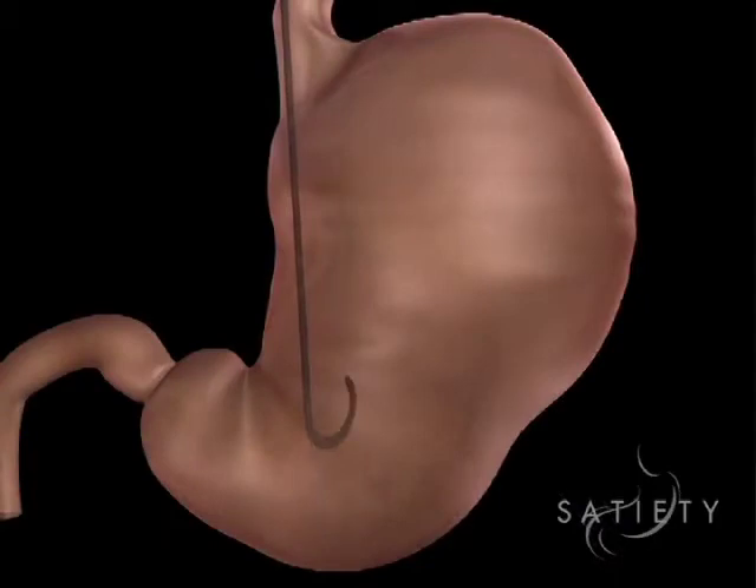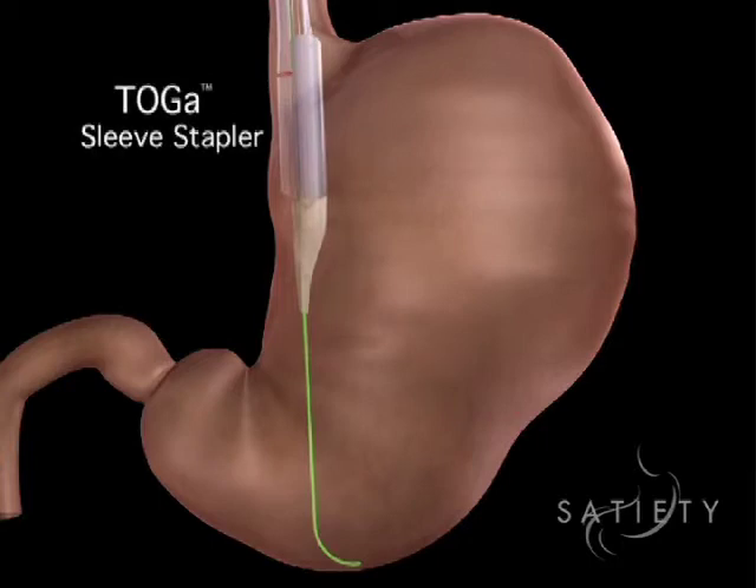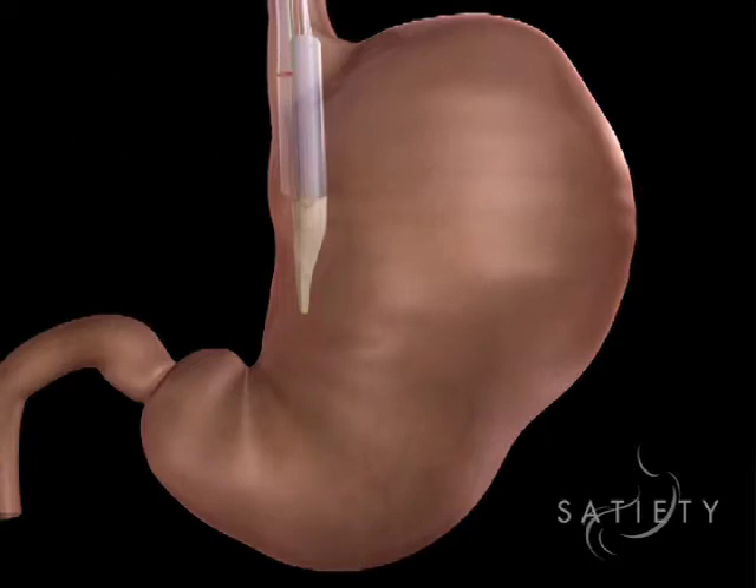As long as the anatomy is fairly normal, we pass a guide wire through that scope into the stomach. Then over that guide wire, we place a bougie dilator. This is about an inch in diameter and gently stretches out the esophagus a little bit to prepare it for the device itself, which is slightly smaller than that bougie dilator.